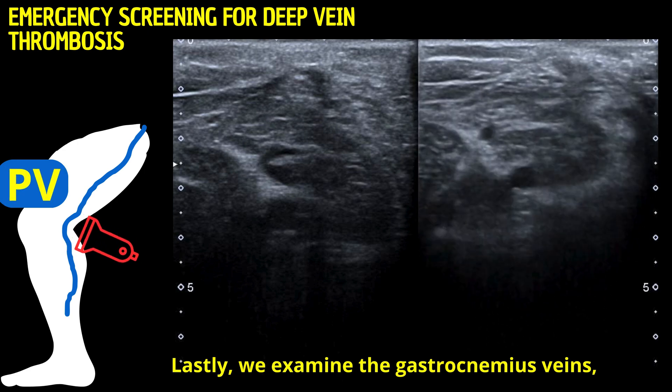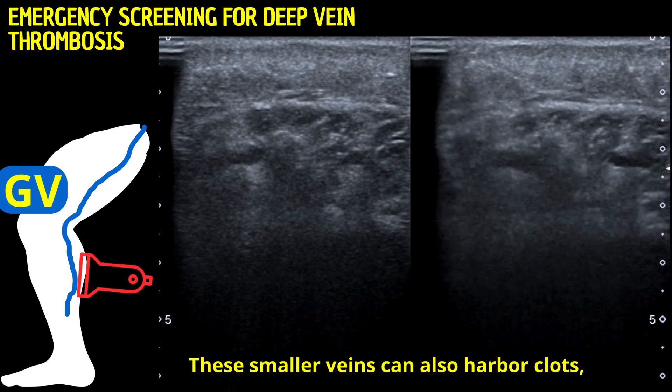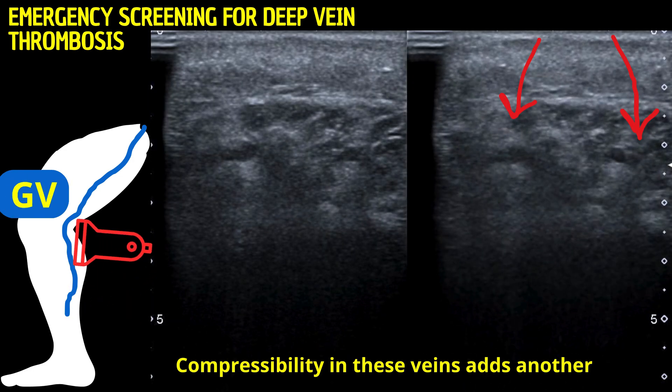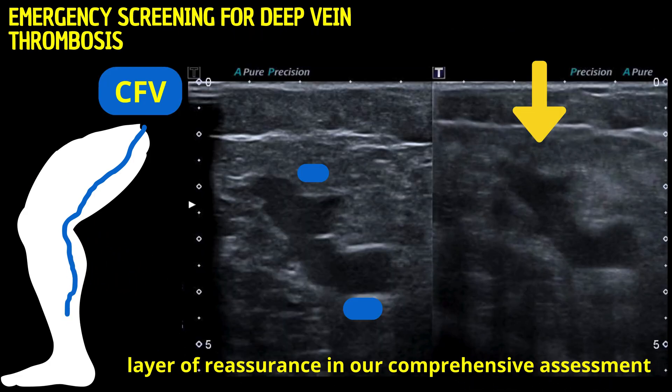Lastly, we examine the gastrocnemius veins, located in the calf. These smaller veins can also harbor clots, especially in patients with limited mobility or other risk factors. Compressibility in these veins adds another layer of reassurance in our comprehensive assessment.